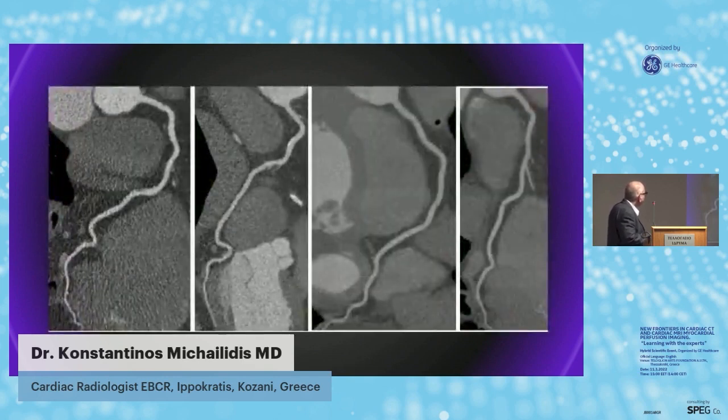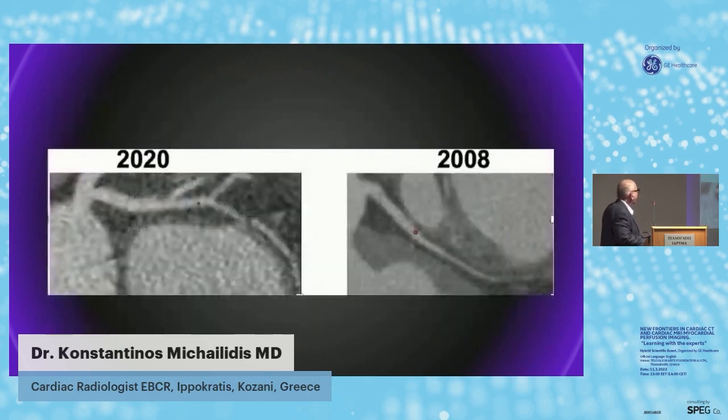And the right coronary artery has, again, a long segment calcified plaque, but there was nothing here when he performed the first study. Not to forget that this patient has really bad family history and really bad dyslipidemia. So, what do we do about this patient? Can we have the next question?